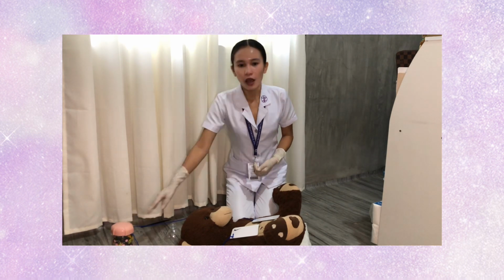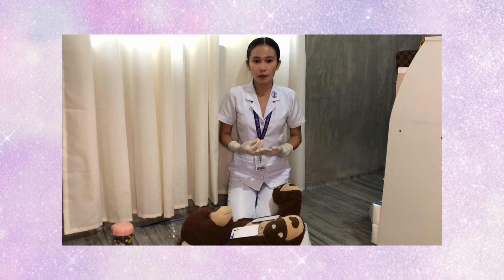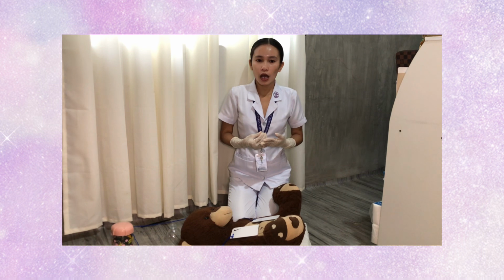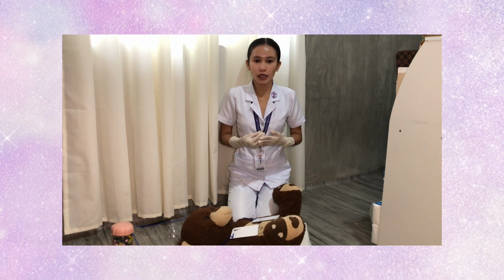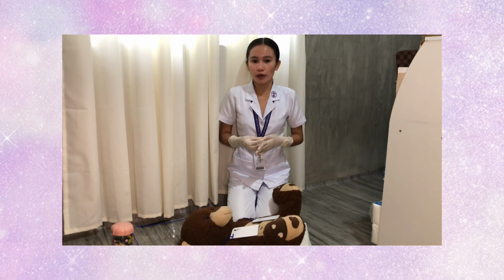After doing that, the AED will tell us to resume the 30 chest compressions and rescue breaths for a number of cycles, and after that we will reanalyze the patient's heart rhythm, and if necessary it will deliver an electric shock again. So we will continue until the AED tells us to stop, or until the patient has been revived. After doing all the procedures, we have to document the procedures done, the time the resuscitation started and the time it ended, and switch roles every 2 minutes or after every 5 cycles.